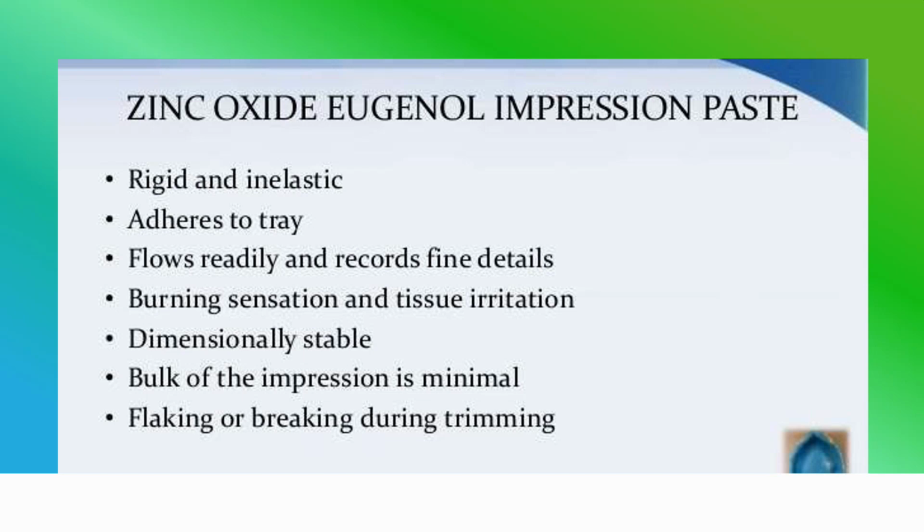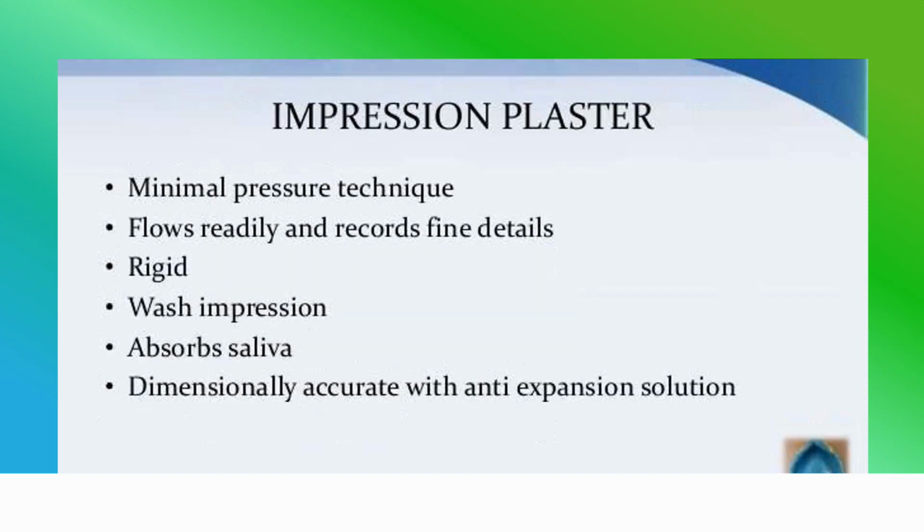ZOE impression paste is rigid and inelastic. It adheres to the tray, flows readily, and can be used for making wash impressions, but the limitations are that it can cause a burning sensation or tissue irritation. It is a rigid material and cannot be applied in areas of undercuts. It can flake or break during trimming.